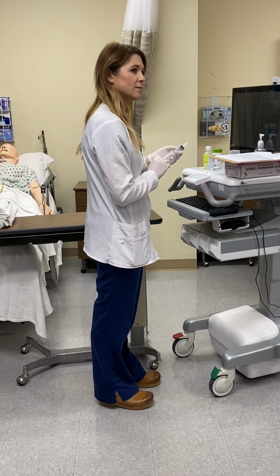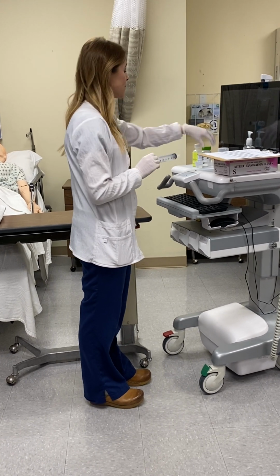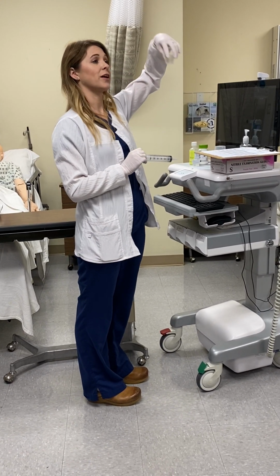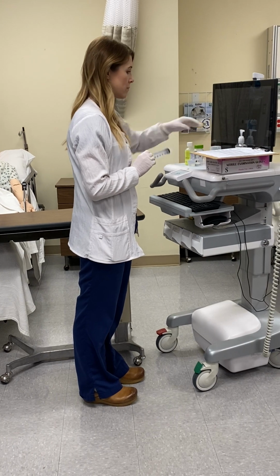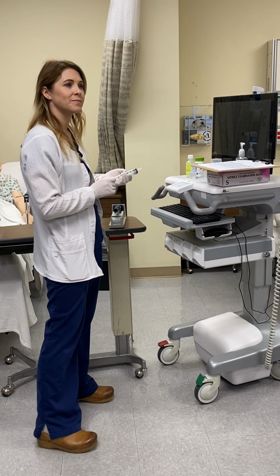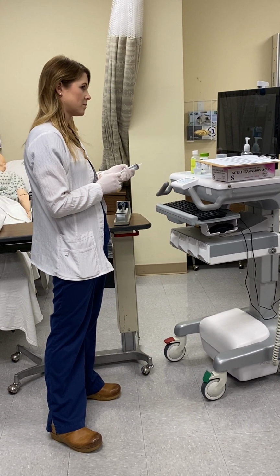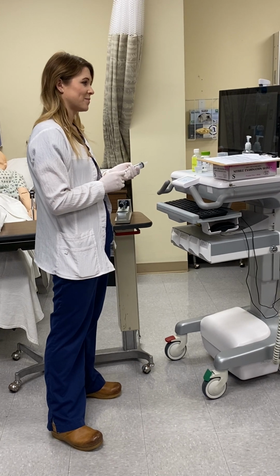There's those things in here. So you don't have to put any water in the bag that you just crushed to make sure you get all the vitamins? I'm about to put it into the cup with the med that's crushed. I mean the sleeve. Like rinse out the sleeve. Oh, rinse the sleeve out? No, I'm saying like for the residue, to make sure you get the whole thing. Right. Okay.